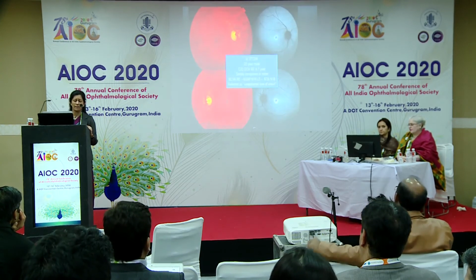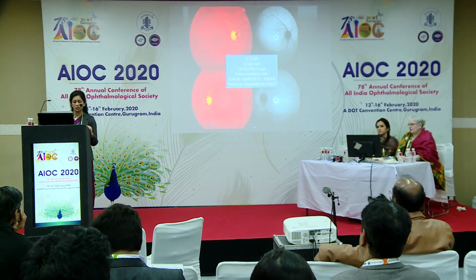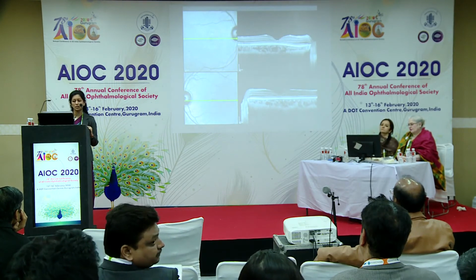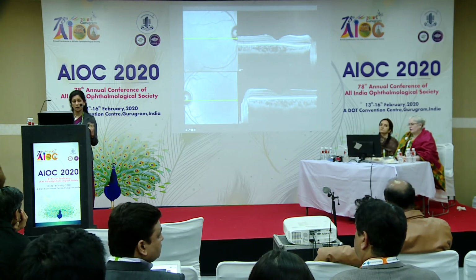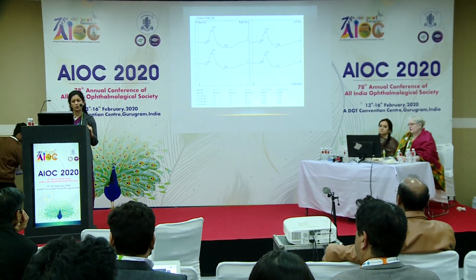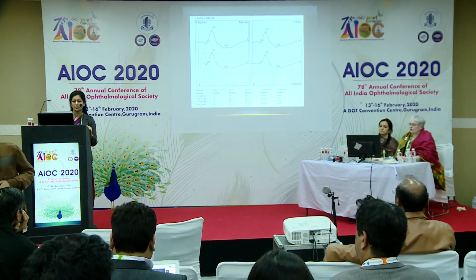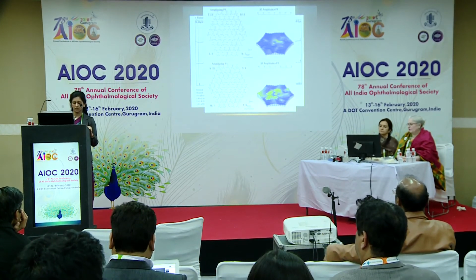Another case of unexplained vision loss with just some hyperautofluorescence, which you can see in a kind of ring form. Family history was positive, and OCT shows you these subtle EZ defects, if you look carefully. So electrophysiology again helps us to point a diagnosis. In this case, the pattern ERG is normal. So anyway, we know it's not Stargardt's by the OCT. So the multifocal ERG is depressed, especially in the rings 1 to 3.